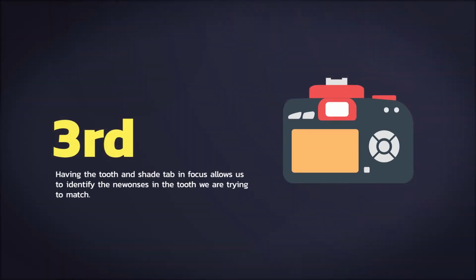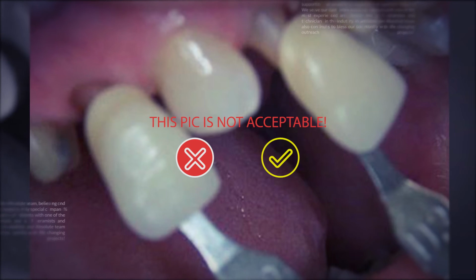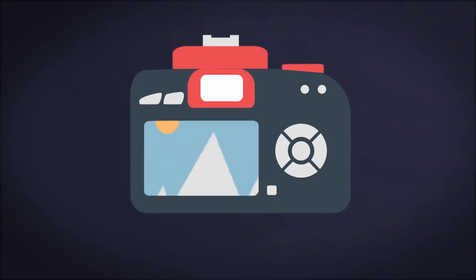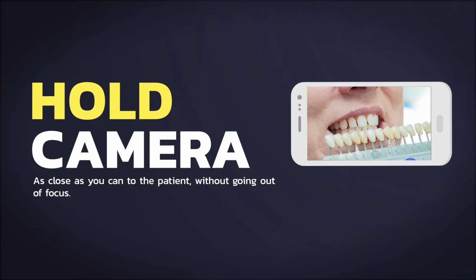Third, having the tooth and shade tab in focus allows us to identify the nuances in the tooth we are trying to match. Many clinicians are even using their cell phones to take these pictures. Focus is more important than zooming in. We can always enlarge the picture with our lab software. Zooming in will lower the quality of the picture. Move the camera as close as you can to the patient without going out of focus.